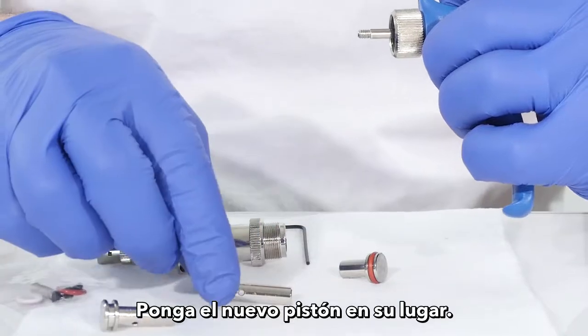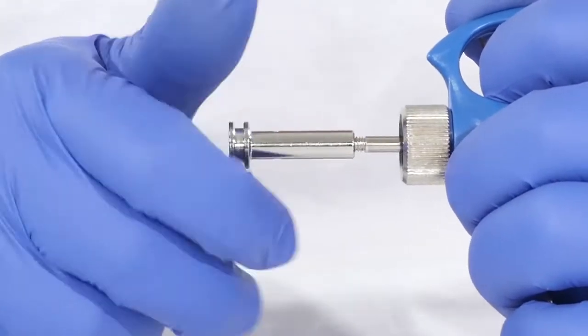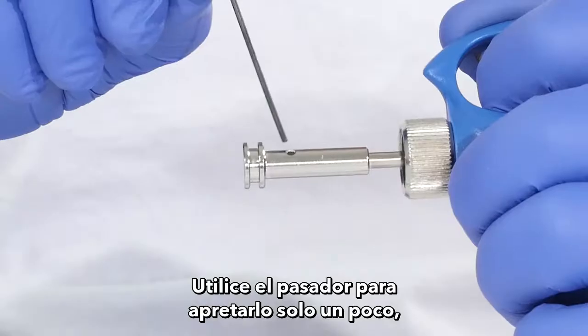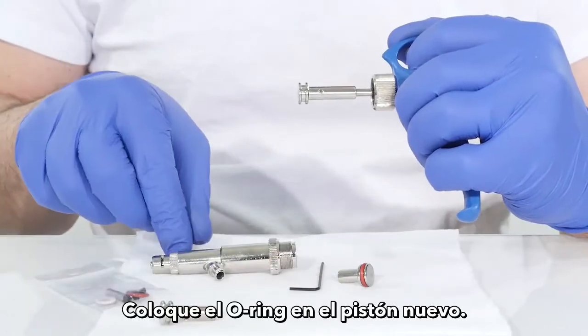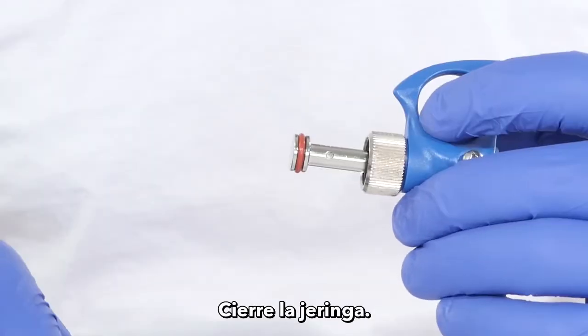Put the new piston in place. Use the key pin to tighten it just a bit — don't overdo it. Place the o-ring on the new piston, then close the syringe.